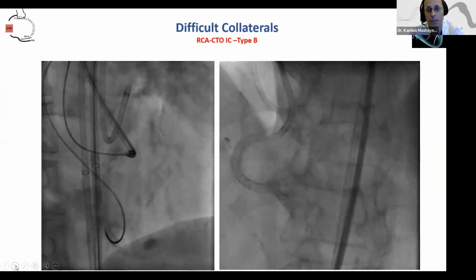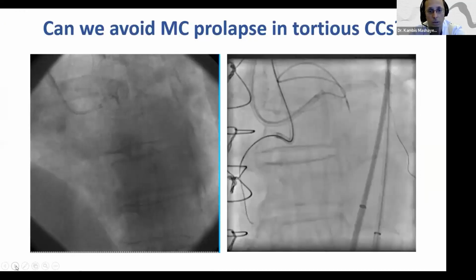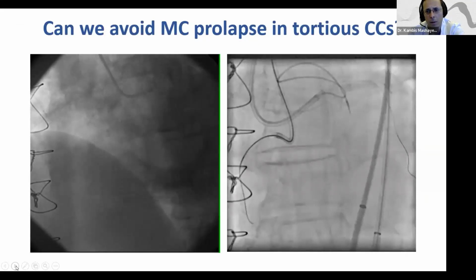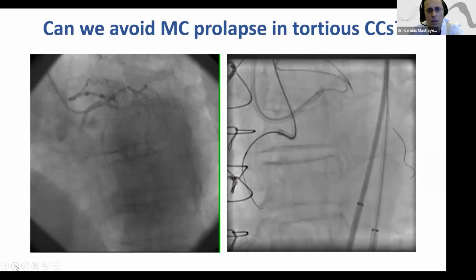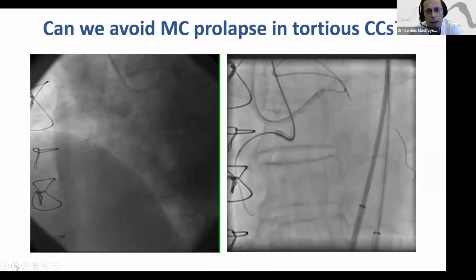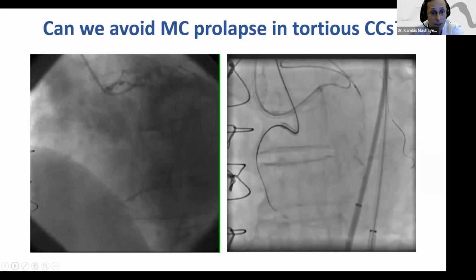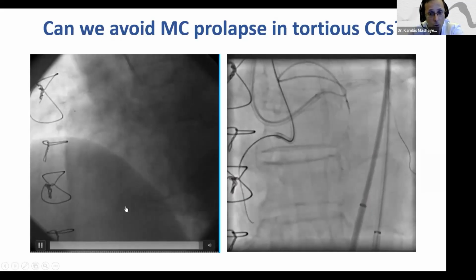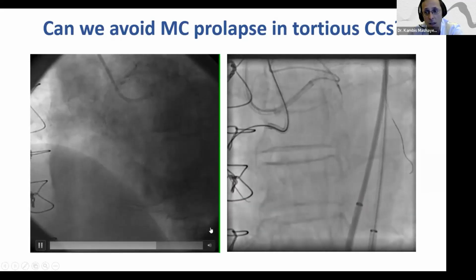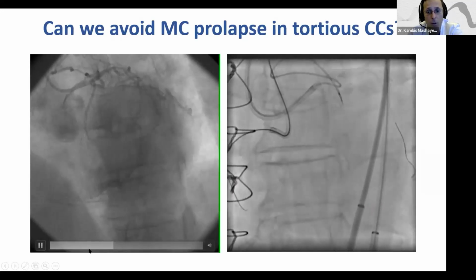So finally, after externalization, a beautiful collateral and a beautiful RCA was the end of this case. Here was another case, a lady, done in Krakow, I remember very well. She had huge ischemia in the circumflex, in the LAD, everywhere, and also in the RCA. Here I failed with antegrade wire escalation. I had no opportunity at this time, and no Stingray available as well. There is another PDA, as you can see here. So finally I decided to go for this epicardial connection.